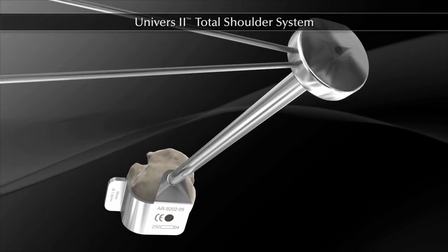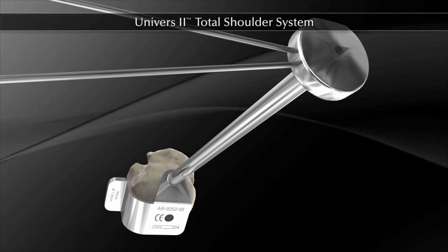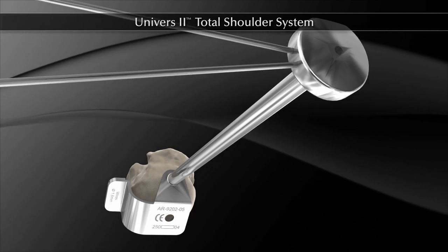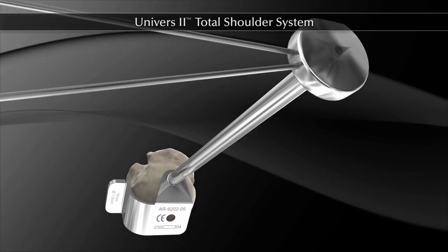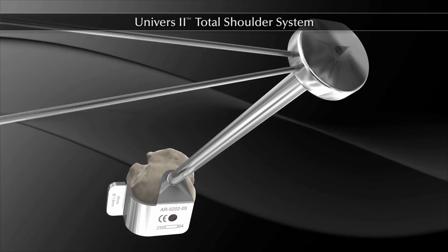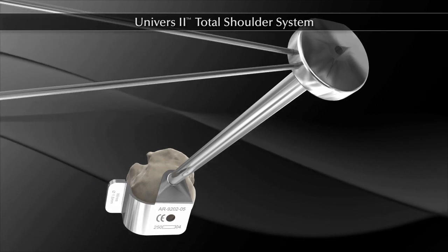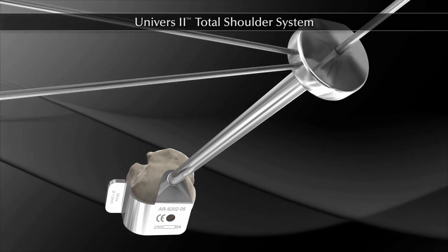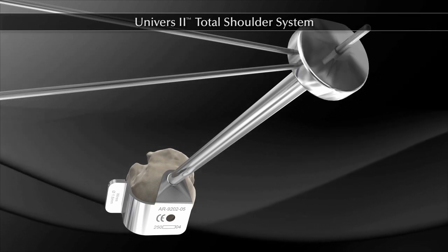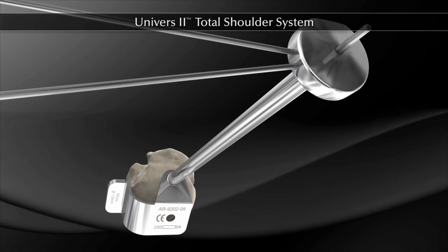The head is then resected with either a freehand technique or using the head resection guide. When the guide is used, the appropriate head resection guide, right or left, large or small, is placed on the humeral head. 1 or 2 version rods are placed in the guide and aligned with the flexed elbow to determine appropriate retroversion. Once position has been established, a 2.8 mm Steinmann pin is advanced down the center cannulation of the resection guide in order to secure the guide to bone.